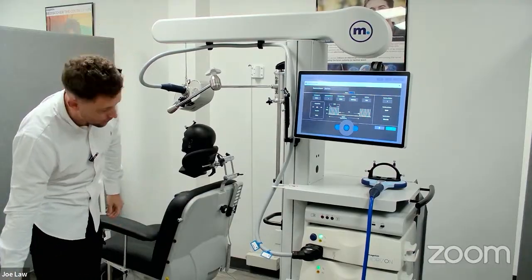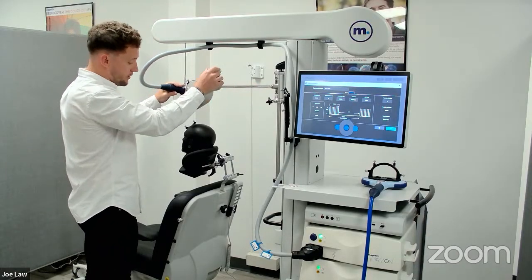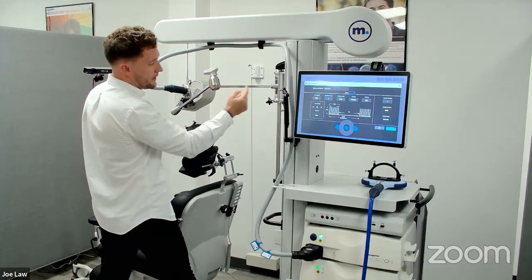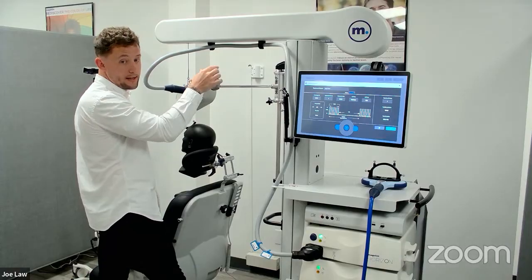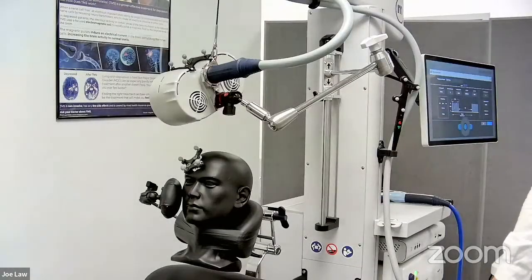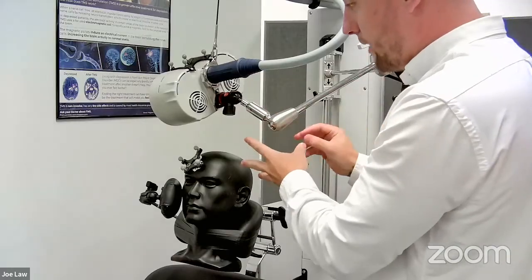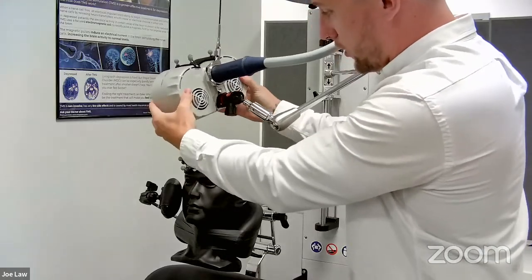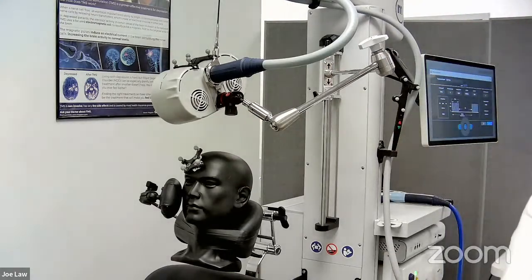The way the arm of the coil moves is actually quite clever. There's what we call a fisso arm here, which allows it to move. If I lock this arm here, it doesn't just lock this joint, it locks 3 joints: here, here, and here, all from this one locking mechanism. Apologies, I'm not sure if you can see this very well. Maybe try switching to the other camera. There is also a fine adjustment tuner here. If you've got everything pretty much within limits, but you want to do some smaller adjustments, you can unlock this here, and this allows you to do smaller adjustments on your patient. So that's a fine adjustment, and the fisso arm itself is the major adjustment.